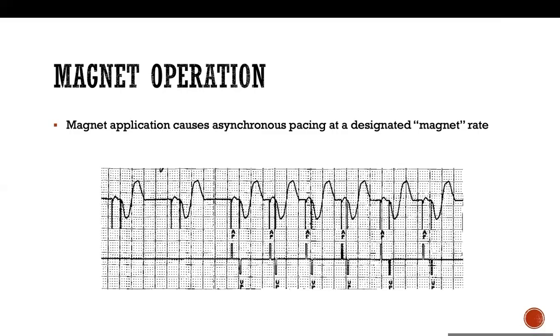So the next, it will disable shocks. But let's say this patient, for example, is requiring pacing. So what does the magnet do for that? In an ICD? An ICD, yes. We said usually the magnet will make the patient pace in an asynchronous mode. I think it doesn't affect it unless the patient is pacemaker dependent. Because ICD is the backup pacing, right?